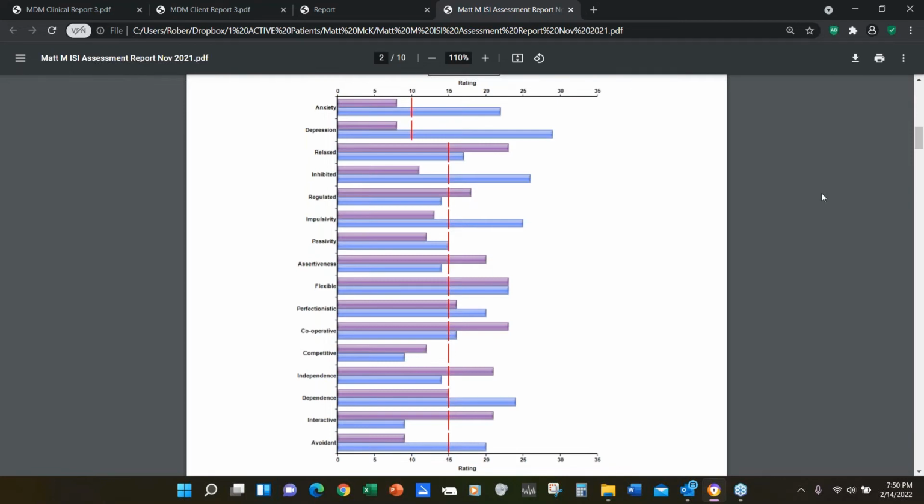And I think maybe I stole this from you, this metaphor of the three-legged stool. I always sit down and say, look, there are three parts to the story. If you take away one of these legs, you can't sit on the stool. There's the physiology, so what's going on in your body and in your cells, and are the neurons in your brain getting what they need? And then there's the emotional, what's happening in your house with your family, what's happening at work, what's happening at school. And the third leg is what's going on in your brain map. And all of this needs to work together, because people come in with ongoing stressors at home.